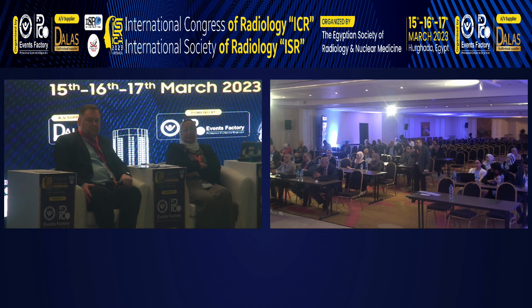Okay, just one more question so as not to take all the time. If you have a PET-MR using PSMA and the nano, would you go for PET-MR PSMA, because now you are combining the high resolution of MRI and the small voxel sizes with the PSMA and doing the exam for the patient in one day because of the compliance? So what's your idea about this?